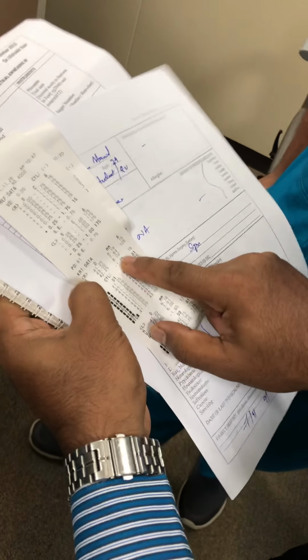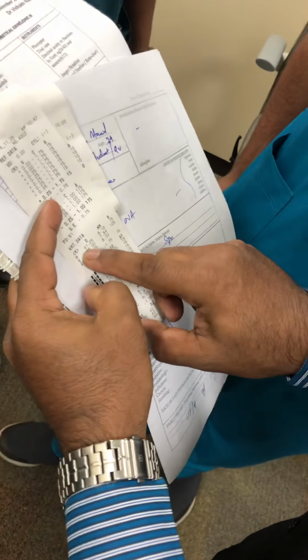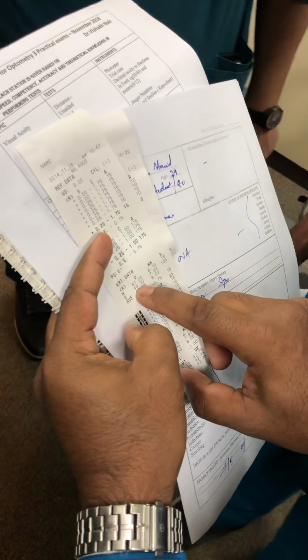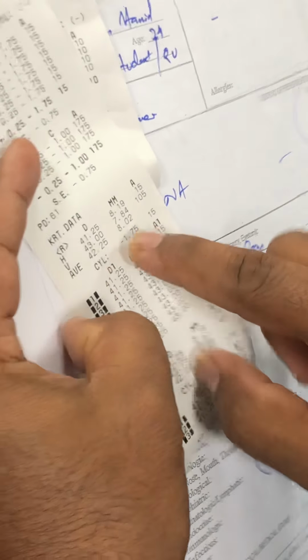And the keratometry shows that, see D1 and D2. How much is it? Horizontal is 41.25 and vertical is 43. So how much astigmatism do you have? The difference is around 1.75. So that means this value and this value are almost the same. See, cylinder is how much? 1.5 here, and cylinder is 1.75 here.